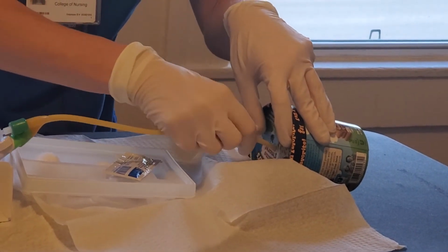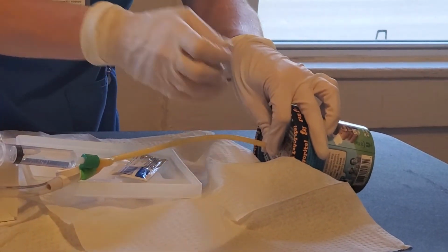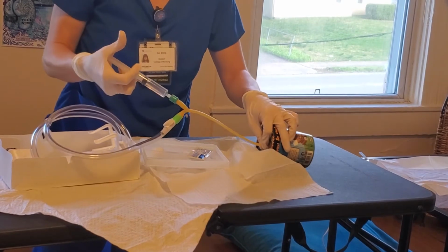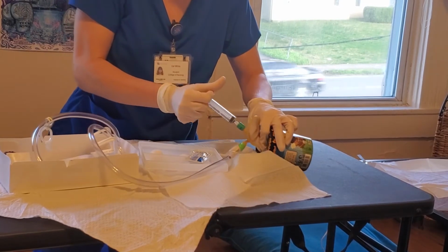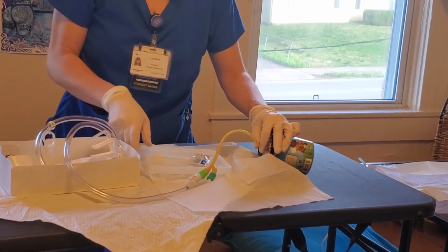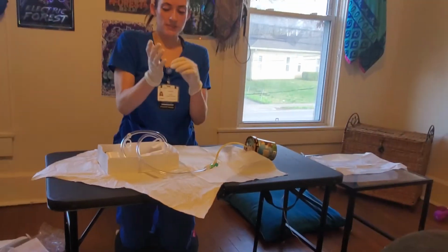So now that we've seen urine, we're actually going to go ahead and insert about 2 more inches. Then we'll use the non-dominant hand to stabilize the catheter, because we have to inject the sterile water to anchor the catheter. I'm going to dispose of this tray here. So the catheter is anchored now. It can release. I'm going to remove my sterile gloves.